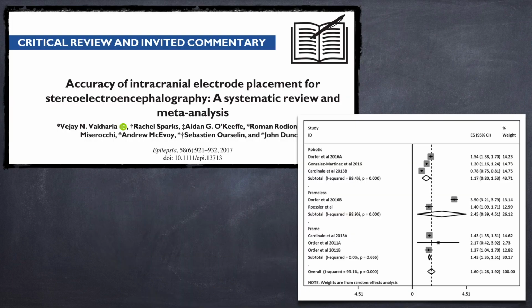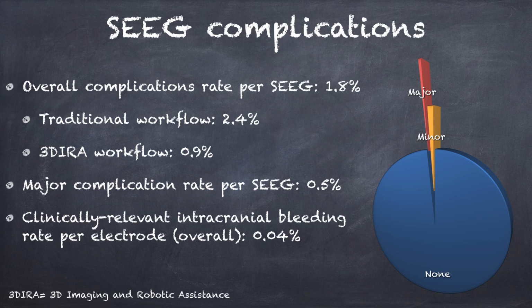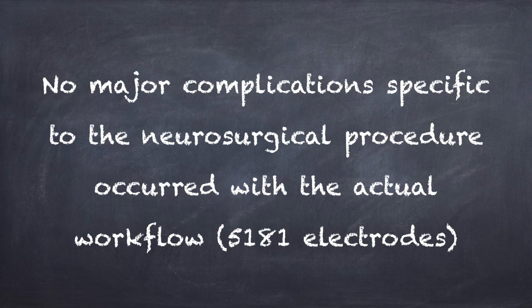A recent meta-analysis showed that our submillimetric accuracy at the cortical entry point, the true risky zone, was the best ever reported. The overall complication rate was lower with the new workflow compared with the traditional procedure, even if not significantly. None of the major bleedings occurred with this new workflow.